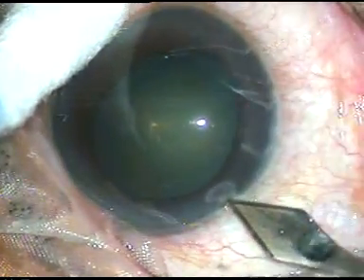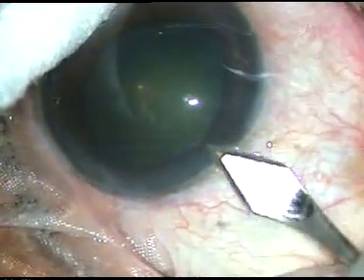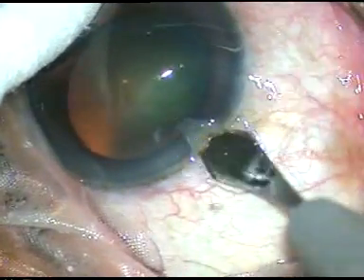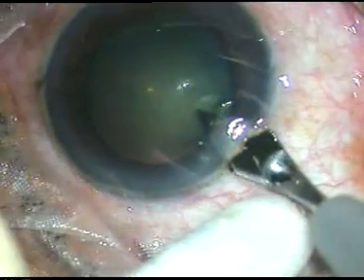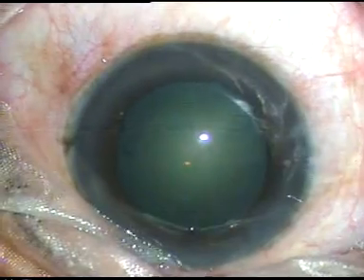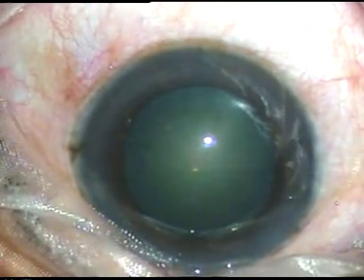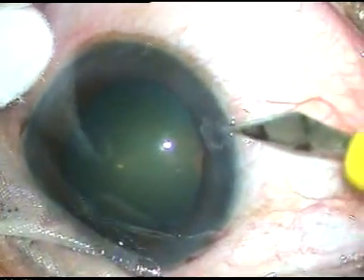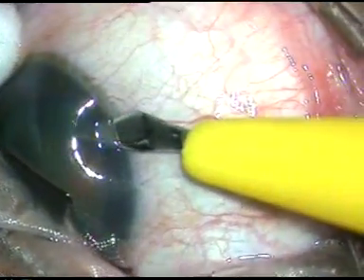The blade goes forward for some distance. Now I give support here to complete the incision, and I come out — there is no leakage of aqueous. This is the side port on the right side of the incision, with no leakage of aqueous humor.